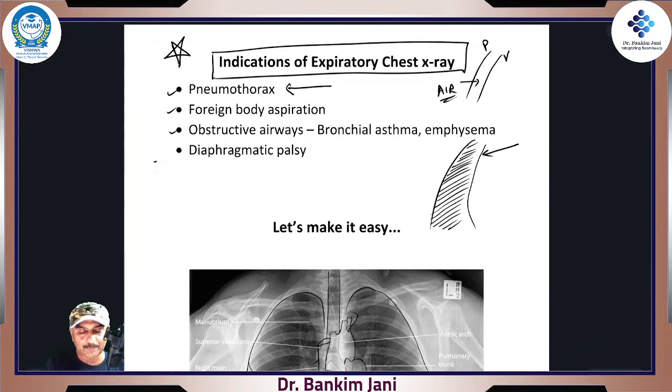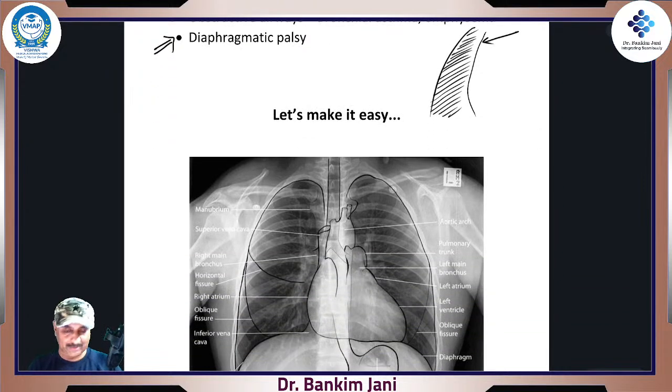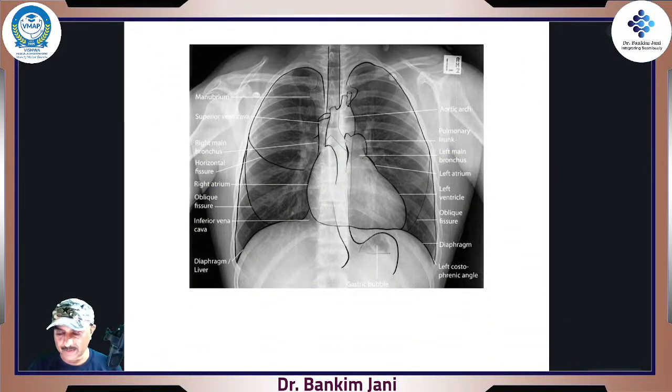And the diaphragmatic palsy. When the diaphragms are paralyzed, we know that during quiet breathing, on breathing in, the diaphragms go low and you breathe in. Then when the diaphragms relax, they go up and we breathe out, right? So here, you see the flattening of those diaphragms, because when they are paralyzed, you won't be able to see them properly. This is one simple explanation.